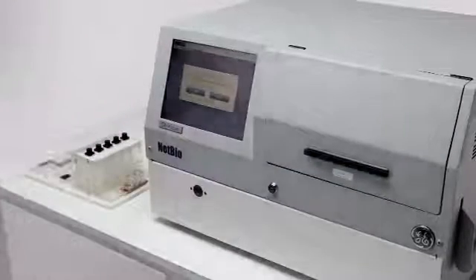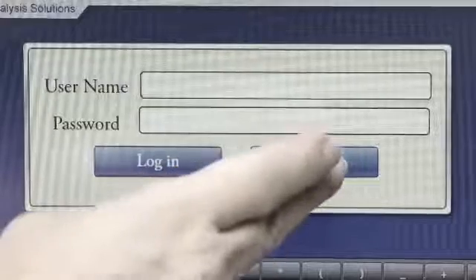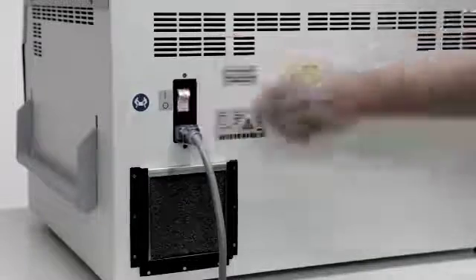If 'Yes' is pressed on the touchscreen monitor, sample loading instructions will appear in preparation for another run. If 'No', the user will have the option to shut down the system or reactivate it for another run. To shut down the instrument, select shut down. When the screen goes blank, flip the power switch to the off position.